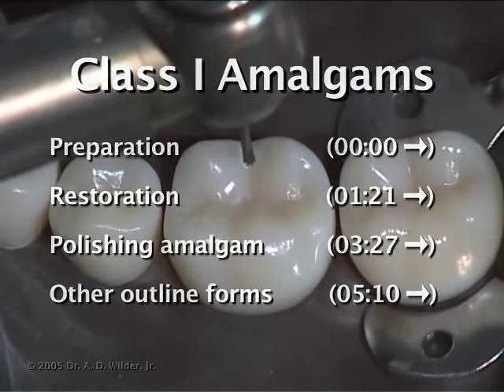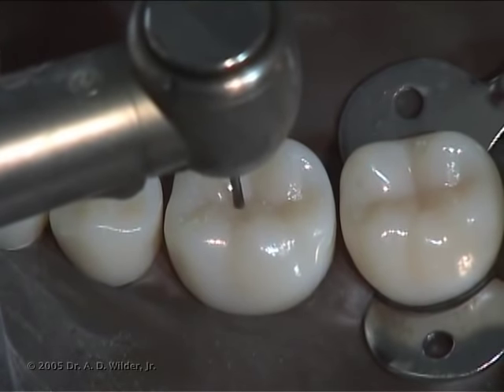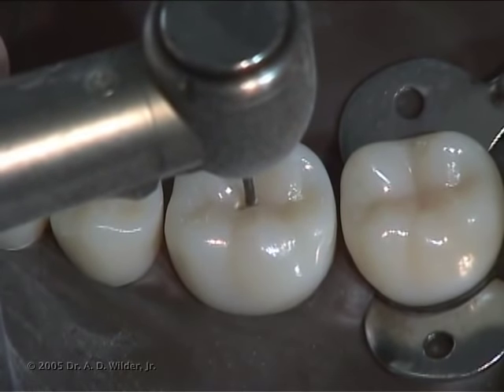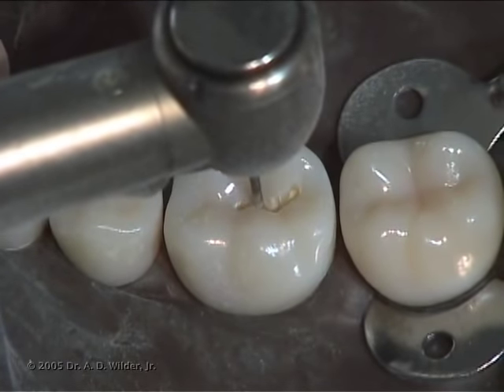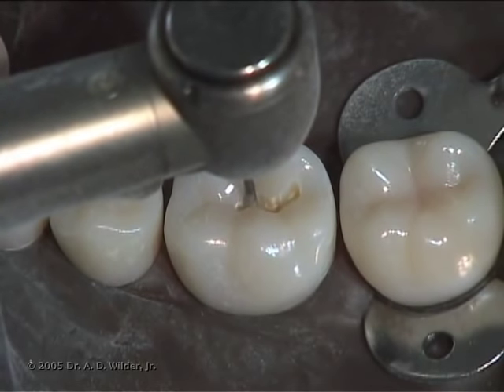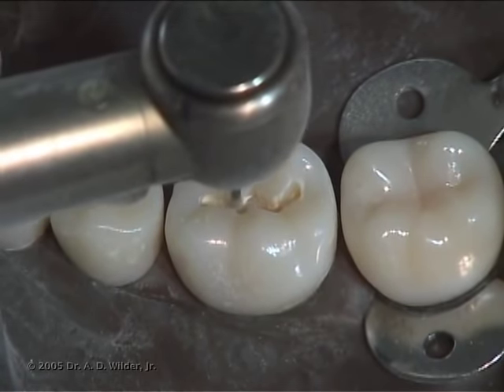First, after anesthesia and isolation, use a carbide or diamond burr in a high-speed handpiece to create the initial punch cut where the caries is most involved. This is typically at the center of a groove or fissure. A carbide burr is generally preferred for amalgam because of the smoother walls it leaves behind. A good guideline is to drop somewhere between half and full length of a 2-45 burr.